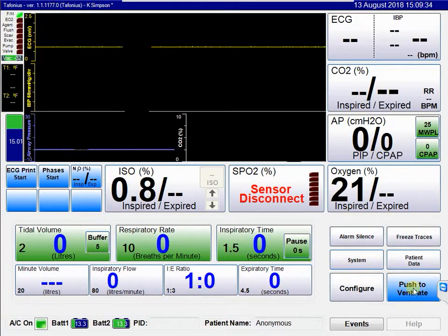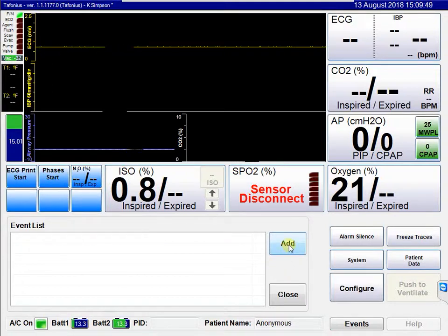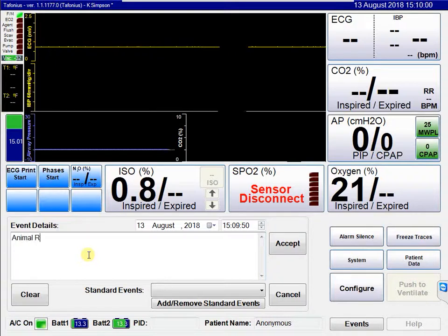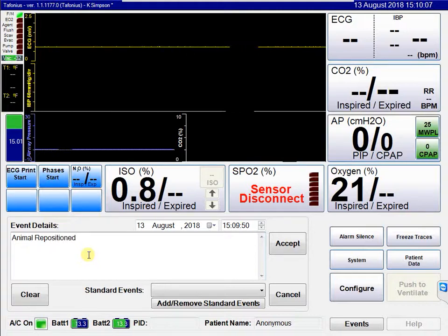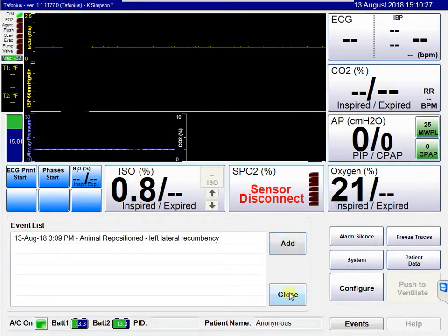The last button is the events button. Clicking on it allows you to add an event at any time, which will be added to the anaesthetic record chart viewable later. For example, clicking add and entering 'animal repositioned recumbency', then accepting and closing, will add that event to the events list.